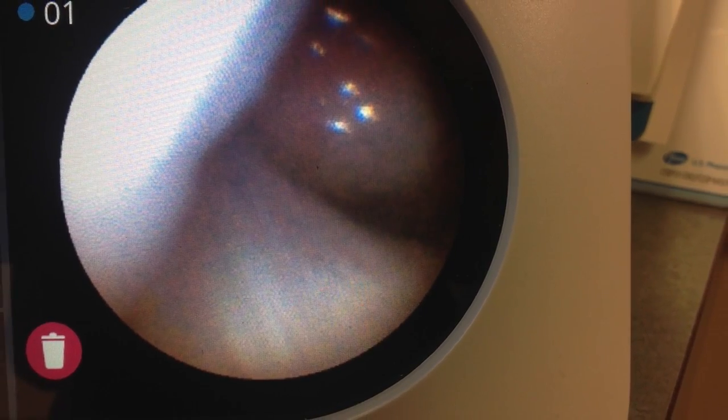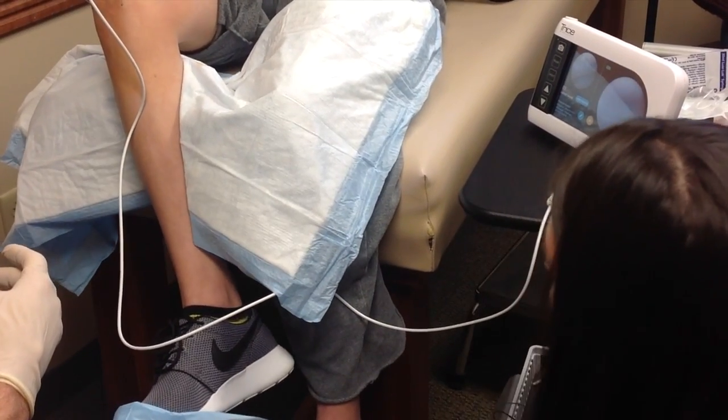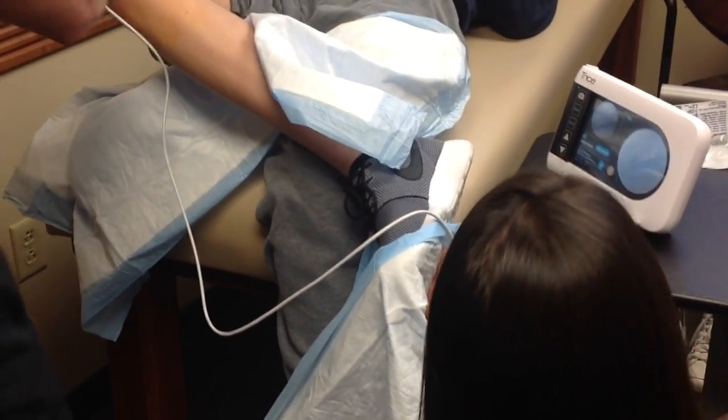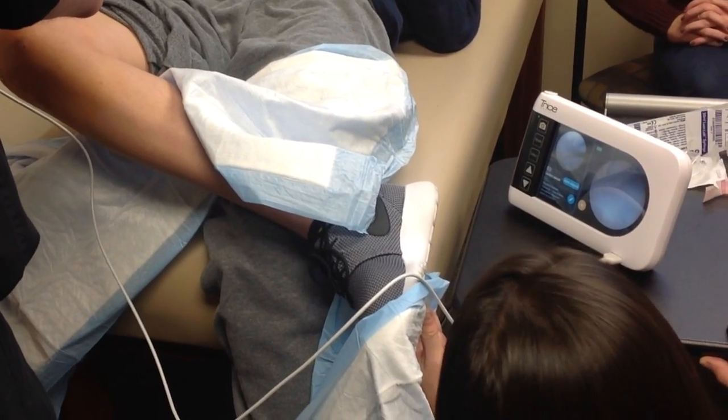There's our ACL in the middle of the screen. To look into the patellofemoral joint, I bring the patient's leg into straight extension. Here we're going into a figure four position, which will allow me to access the lateral compartment, where we can inspect our lateral meniscus.